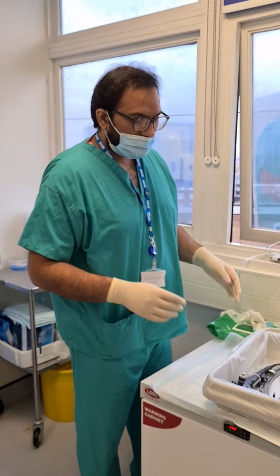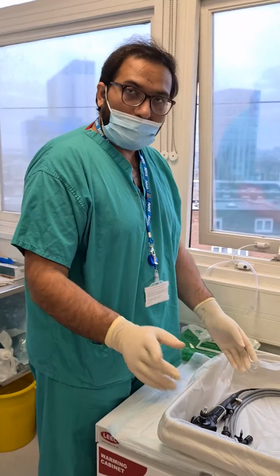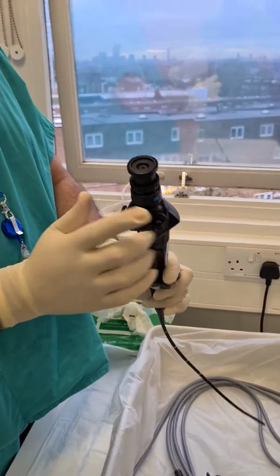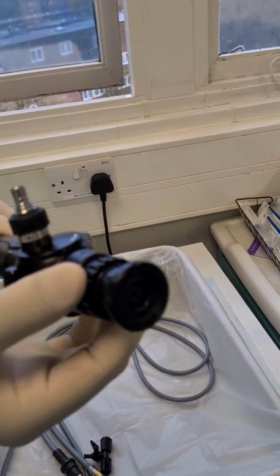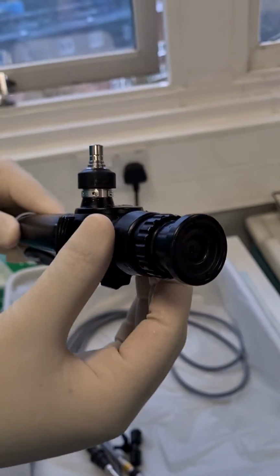Yeah. So today we are going to see what a flexible cystoscope looks like. Arnold, you can focus here. Okay, you can come here with me. So this is the ocular piece and ocular window, just like anything else. This is to focus the camera. The camera will be fitted here, obviously.